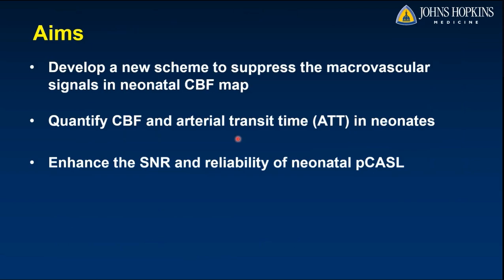With that, we would like to improve the overall quality of CBF measurements in neonates. So we would like to develop a new scheme to suppress the macrovascular signal in the neonatal CBF map. Also, based on that, we can quantify CBF and arterial transit time in neonates, which can provide valuable information in determining the protocols to use in neonatal ASL. And of course, we want to enhance the SNR and reliability of neonatal pCASL.